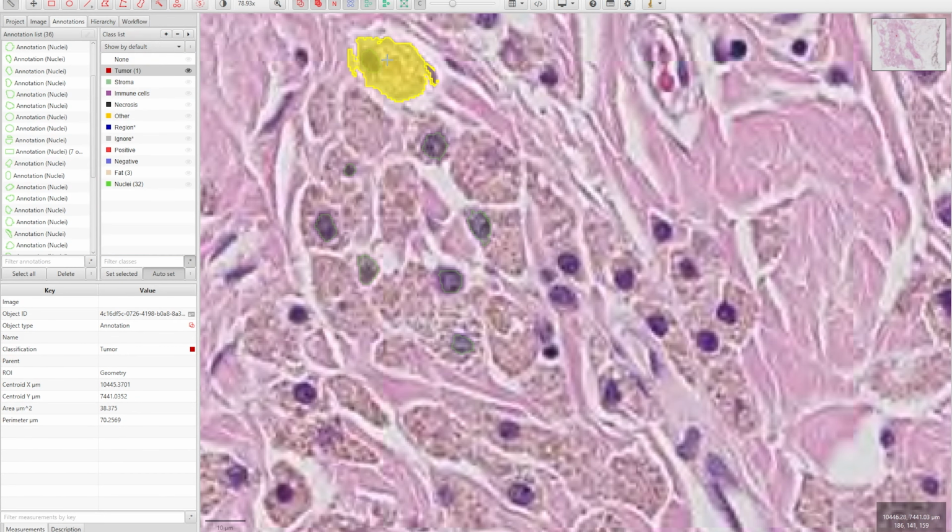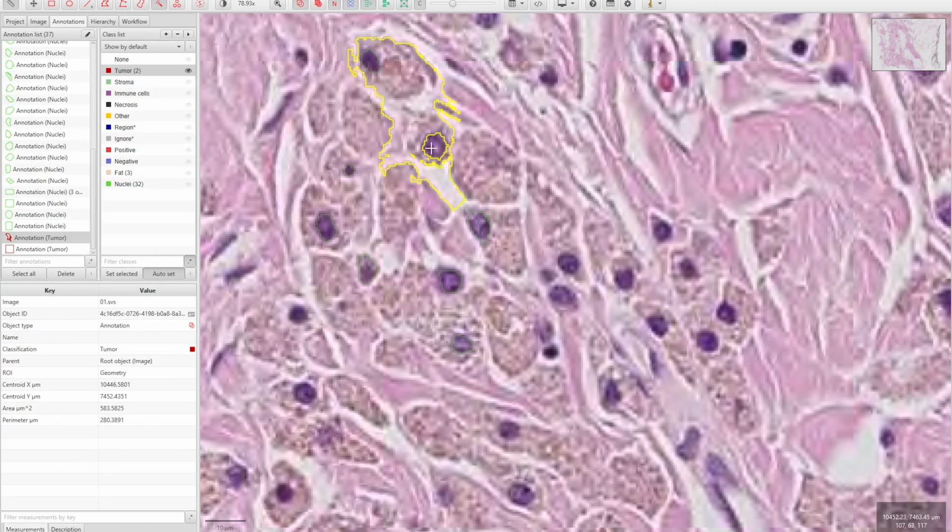So by default, it will annotate this region. But if you press Alt Shift, it will deselect. So if I press Alt Shift during my annotation here and make a deselection inside this region, it will deselect it. So I'm here again, I will continue annotation and press deselect, it will deselect. So I need to do annotations here like that.